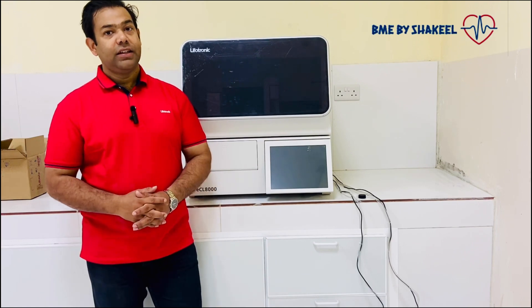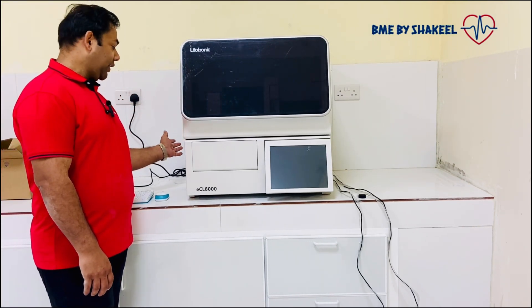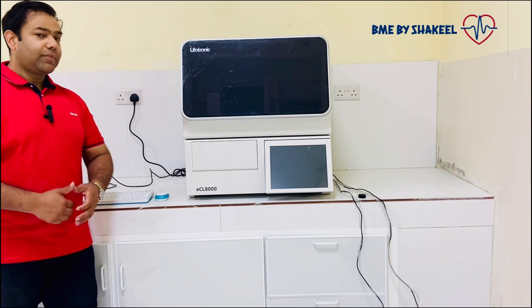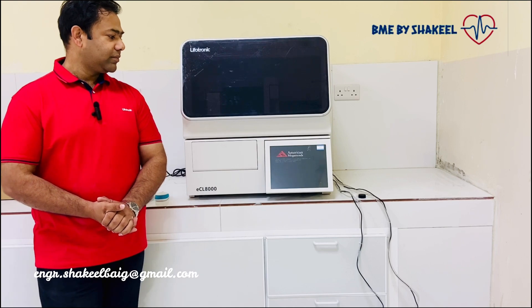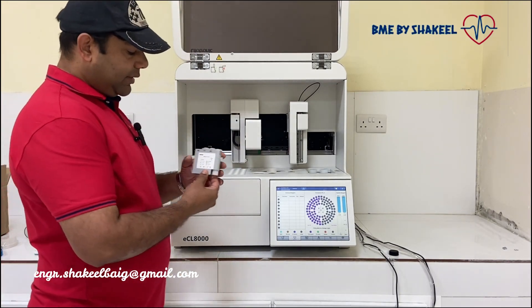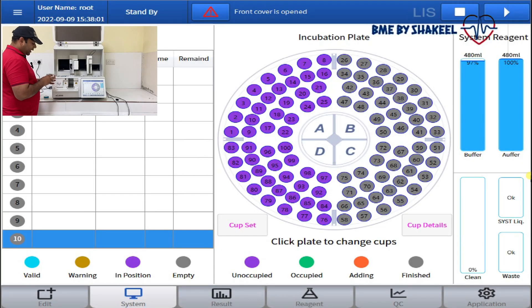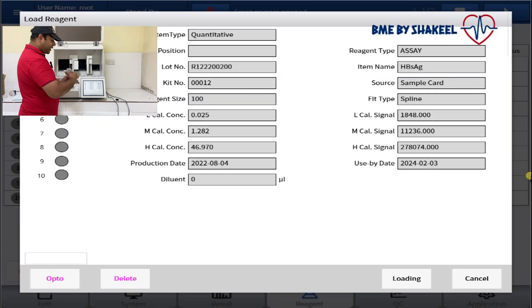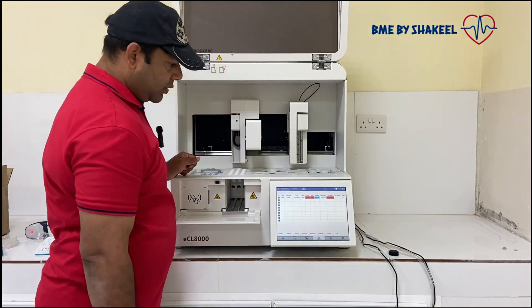Now everything is ready and I'm going to switch on the analyzer. On the left side there are two switches — one for the host system and one for the refrigeration. I'll switch on both. Now it is starting. I will now explain how to load the reagents. This is the hepatitis B reagent — don't forget to remove the seal. Open it and place it in position number one. Now it is loaded.